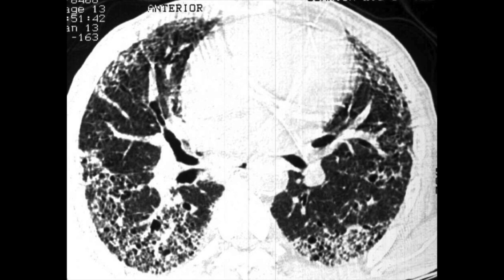This is a full-blown chronic irreversible UIP pattern in a male patient over 50 years. You can safely call it IPF provided you also have the clinical backup. You have bilateral basal honeycombing, architectural distortion mainly in the lower lobes. So this is a typical chronic stage of IPF.